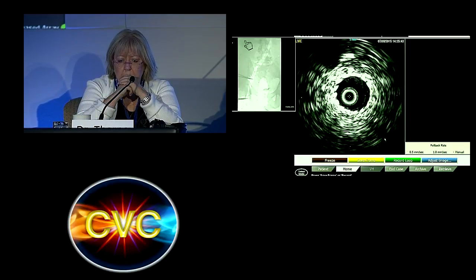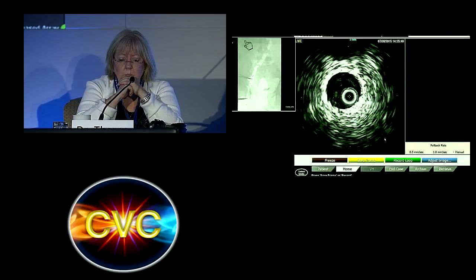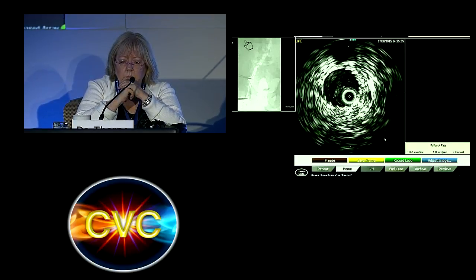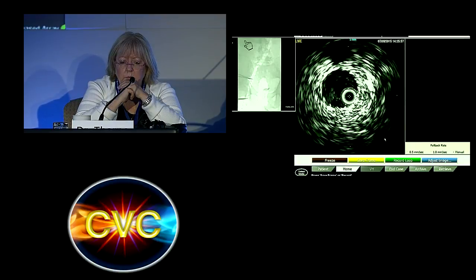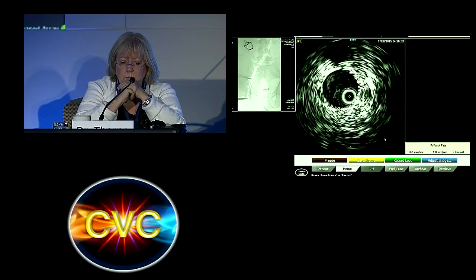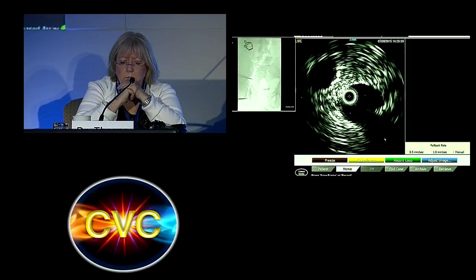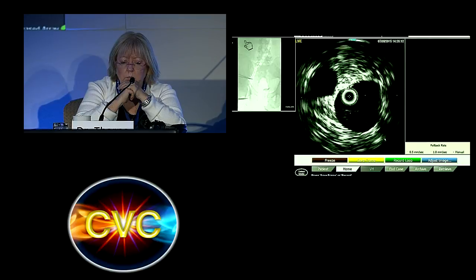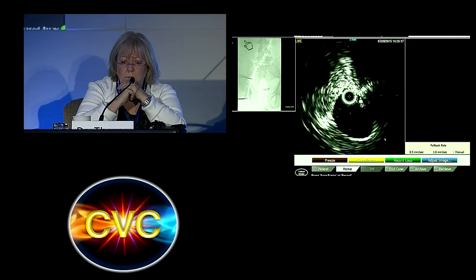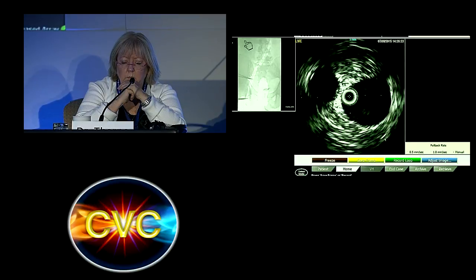I don't know about you guys, but this doesn't look that terrible to me. The stent is widely open, well opposed. I think what I would do is give a chance to this patient and see. We follow him, and then we see how he's doing. I think the main problem this fellow had lies in the common femoral. I think we did the stenting. Hopefully that will stay open, keeping him on his Coumadin. But I think it's not a bad result, even at that area at the beginning of the external.